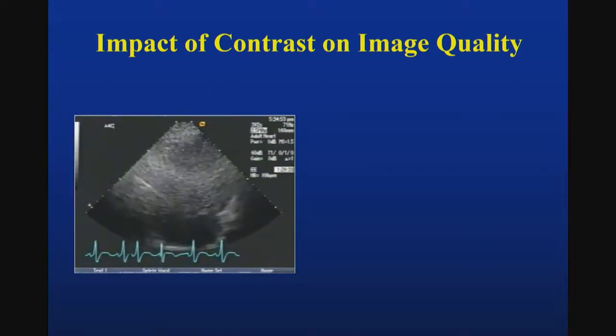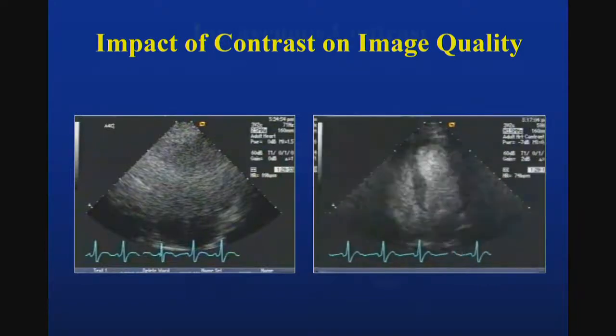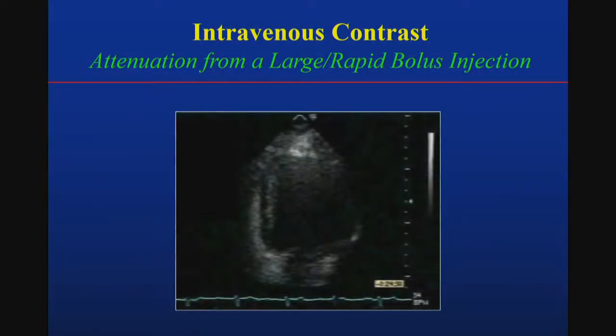One, we usually don't like to show such non-revealing echocardiograms on the left side, but indeed, if you use contrast appropriately, you could take an uninterpretable image into an interpretable one. Not only can you interpret, but you can even measure ventricular size, thickness, even mass, and ejection fraction. So it really converts an uninterpretable examination into one that can be interpreted. So very important is technique, okay?